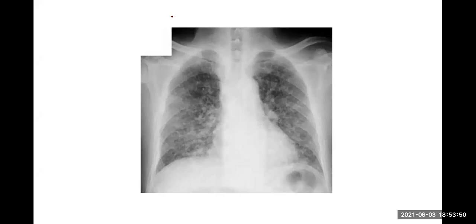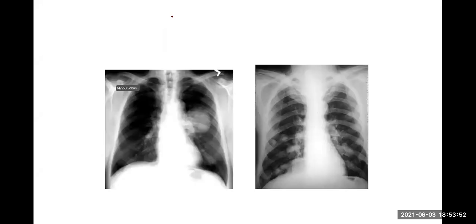Okay, this is again a similar thing. Now here you see larger ones. Okay? That's a solitary nodule in a lung. A solitary nodule in the lung could be due to an adenoma of the lung, or a carcinoma of the lung. Right.